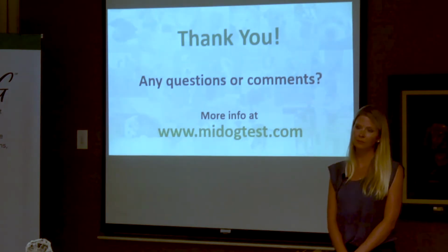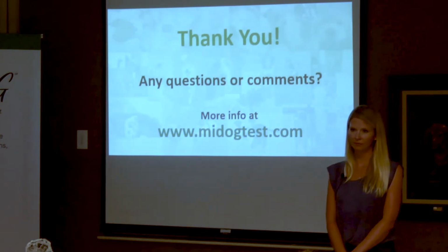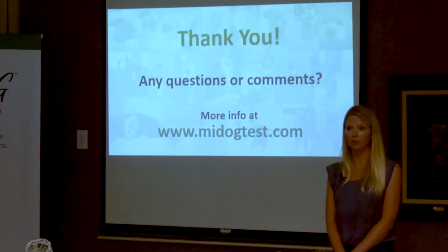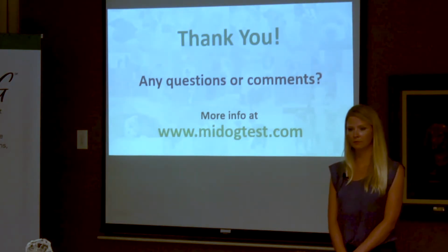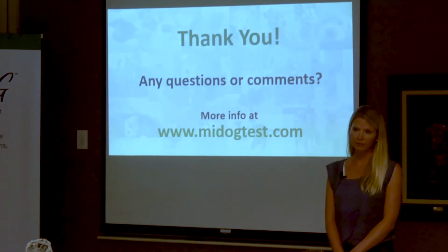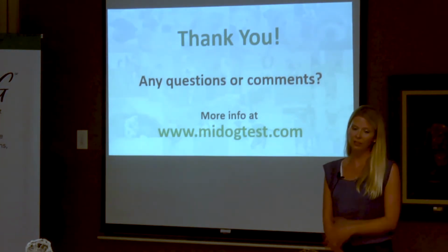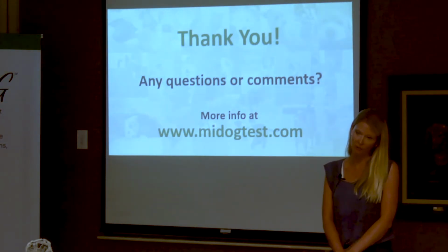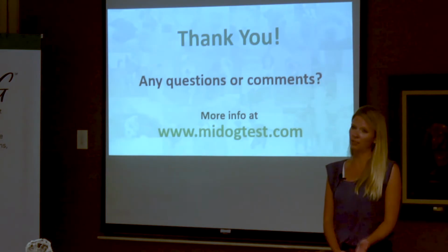So that's another question I have: say I am treating somebody with antimicrobials or antifungals, and then I want to do a MiDOG sample, how does that affect the interpretation? Well, it will affect the microbiome drastically, of course. If I am treating with antibiotics and then I do this and I get a result, I can then transfer to whatever other antibiotic your testing indicates would be the best. Yes, exactly. So you will still see what pathogens are there. Have they responded already? It also depends on how long the patient has been on antibiotics, and how long the washout has been.